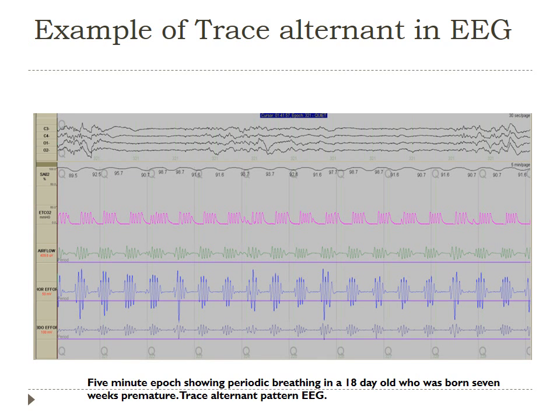Here's an example of trace alternant in EEG. This is a five-minute epoch showing periodic breathing in an 18-day-old born seven weeks premature. You can see the trace alternant pattern in the EEG repeating itself as it goes along.